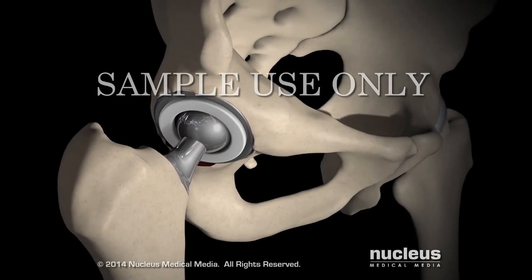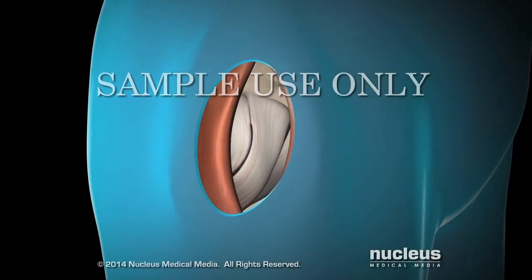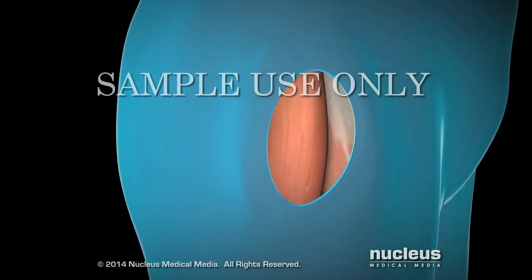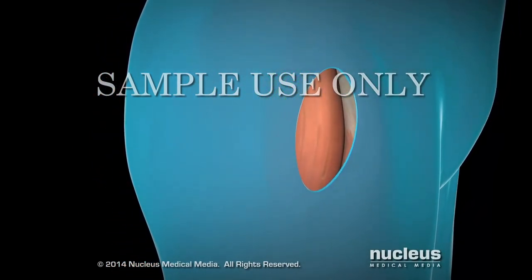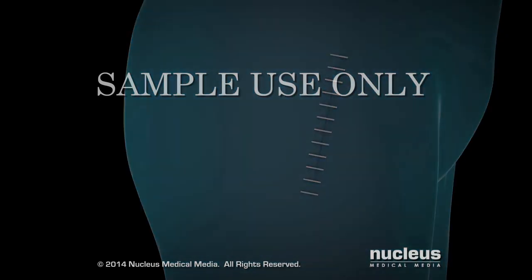Your surgeon will then close the joint capsule and reposition your muscles. He or she may place a drain in your hip to remove excess fluid and close the incision with stitches or staples.